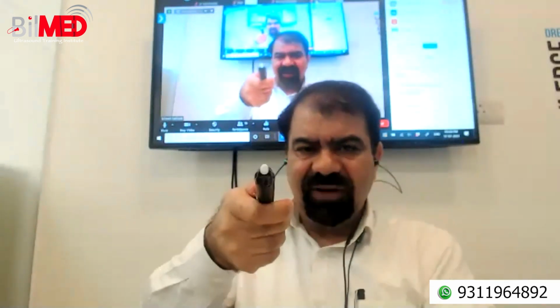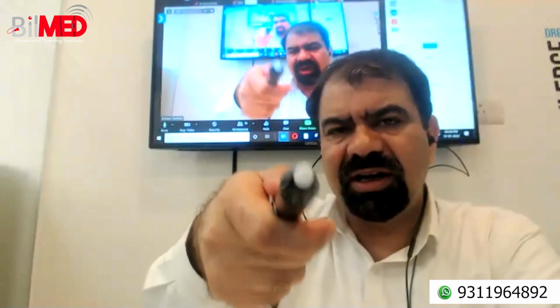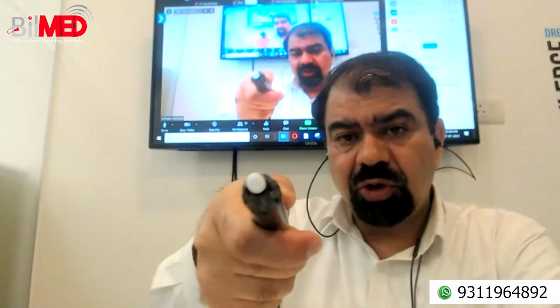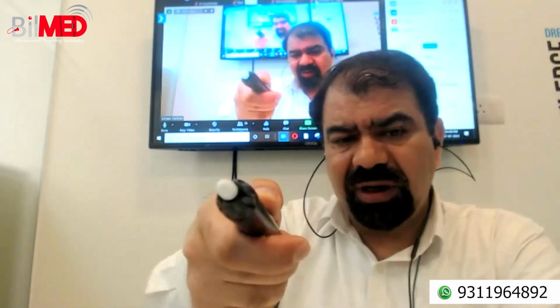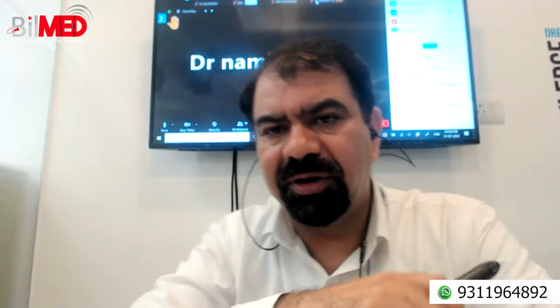Imagine this is the TVS probe. I have inserted the TVS probe this way, right? Now I am seeing on the ultrasound monitor the uterus in length. Yes, sir. Should I rotate it? Not rotate. Should I tilt it this way to take the multiple sections, or this way? Sir, right to left, this side. Very good. Right to left.